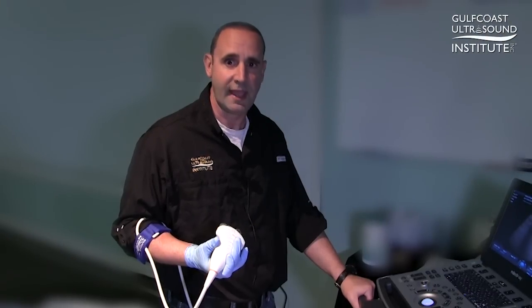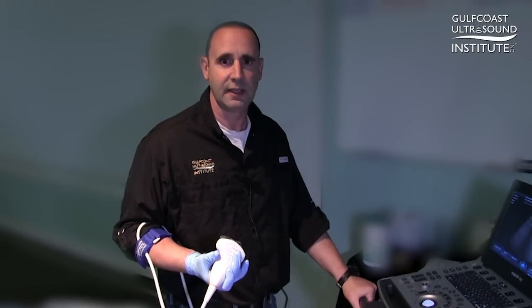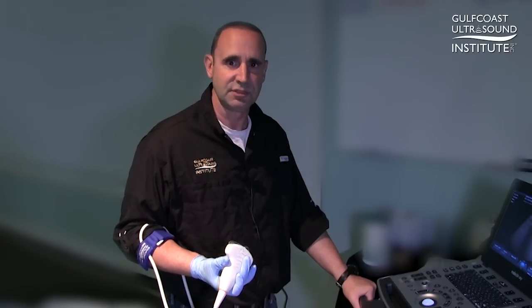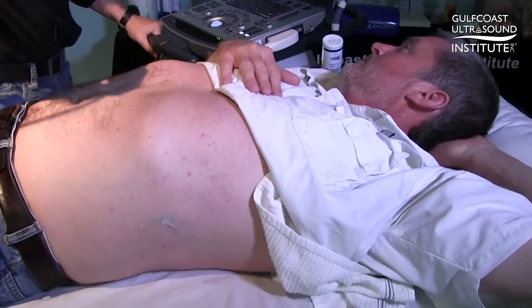And today's hot tip is scanning the spleen. For some of you, this may be old hat. This helps you find the spleen rather easily. If your patient can't lie in the right lateral decubitus position, then they can remain in supine position, and they can raise their left arm up and position it by their head.